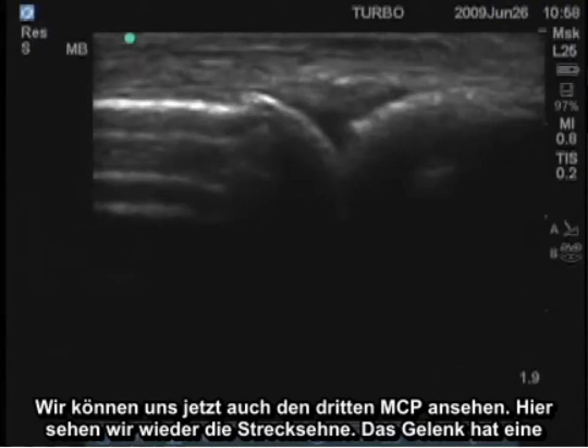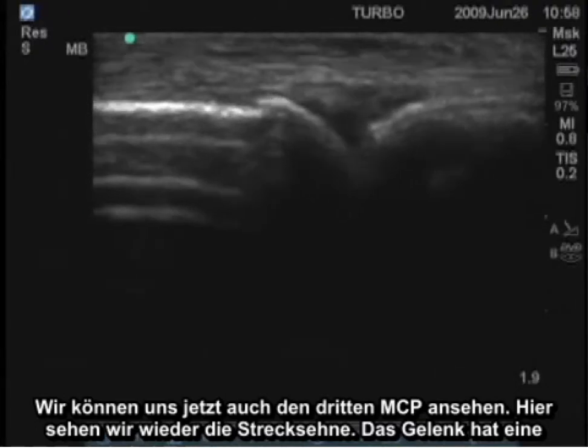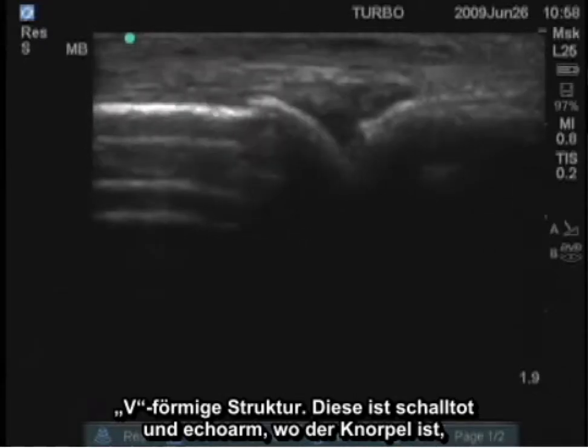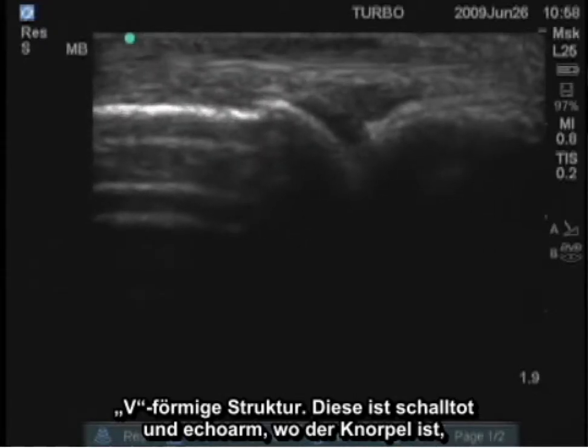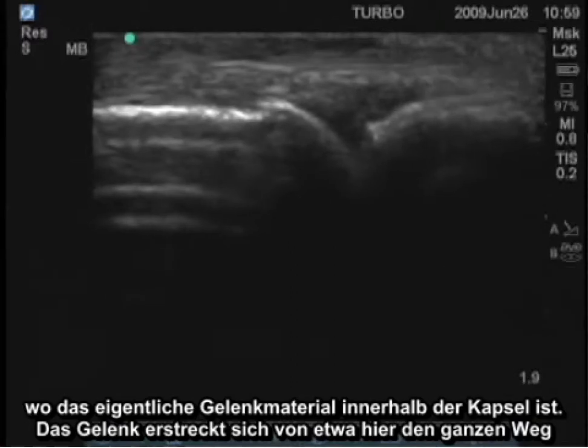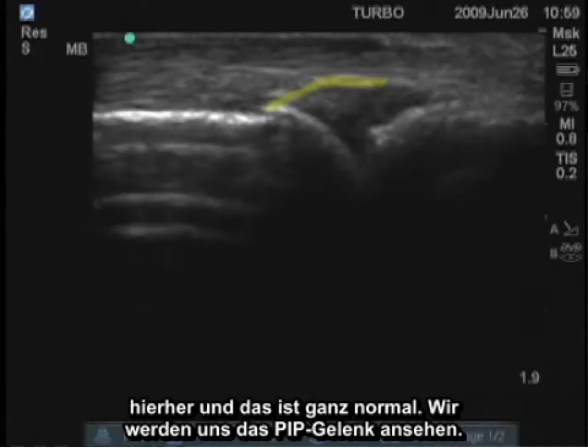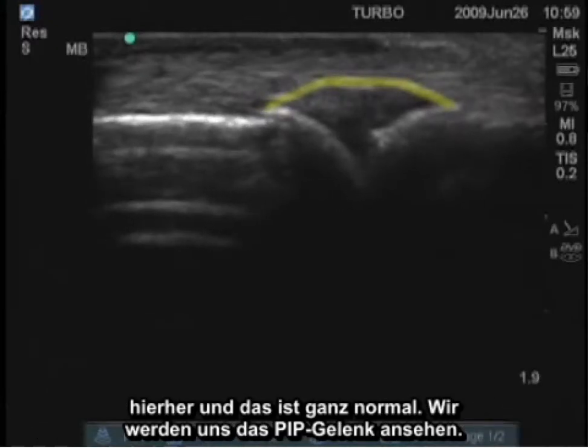We can also now look at the third MCP. Here again we see the extensor tendon, the joint — this V-shaped structure. This is anechoic where the cartilage is and hypoechoic where the actual joint material is within the capsule. The joint extends from approximately here all the way over to here, and that's quite normal.